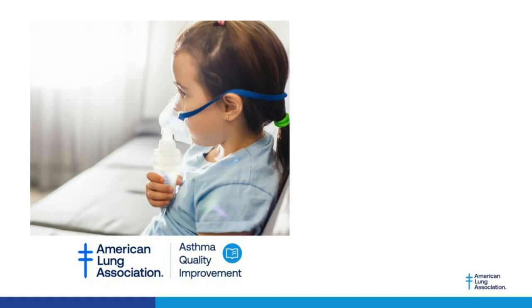And so we wait 21 days, and then we go ahead and test the patient. Spirometry, full pulmonary function testing. Again, using all the precautions, right? Aerosol generating procedures, full PPE, everything, even though the patient has had COVID 21 days before. Good question. Thank you, Ed.